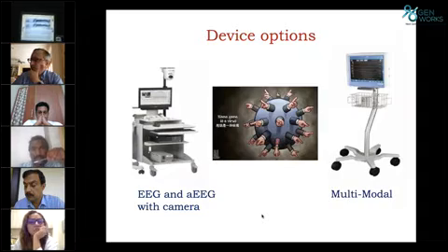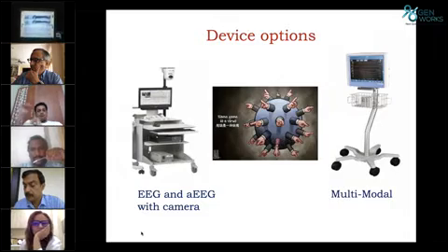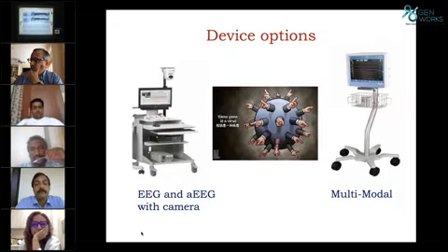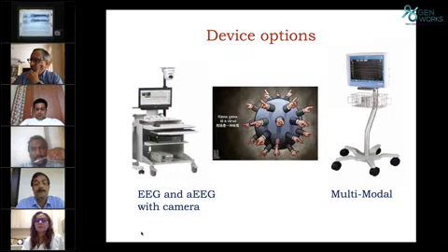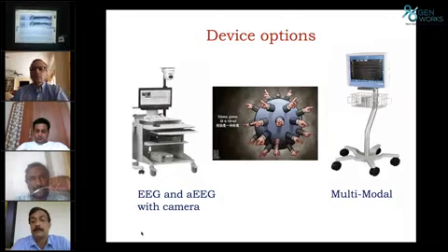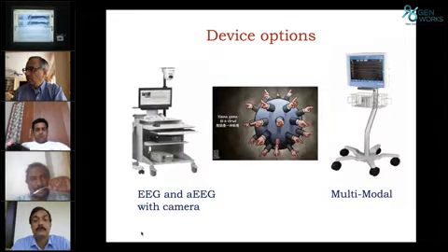Next, whatever changes in the tracings can be noted on the machine as well as in any electronic monitoring system, or noted in our case sheet. Whatever tracings are coming to the monitor, she should be able to note. If we are using both right and left, they have to note the minimum voltage as well as the maximum voltage.